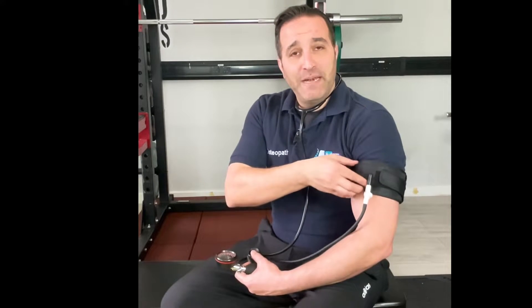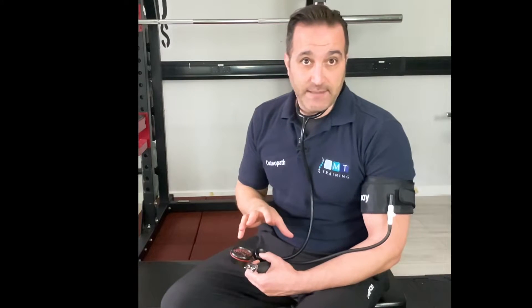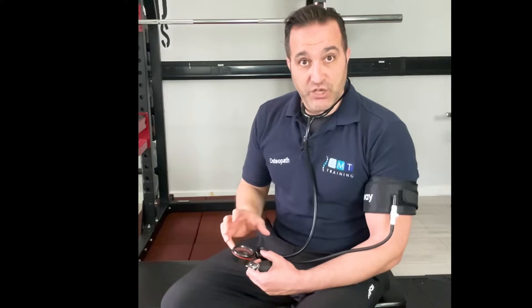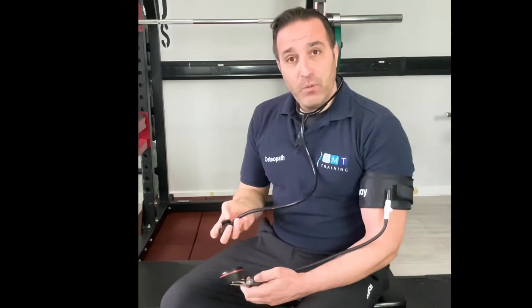You can see I have the upper limb cuff on ready here. Generally, across the board, you're looking somewhere around 40 or 50 percent of limb occlusion pressure. So what does that actually mean? There are a couple of ways you can work this out.